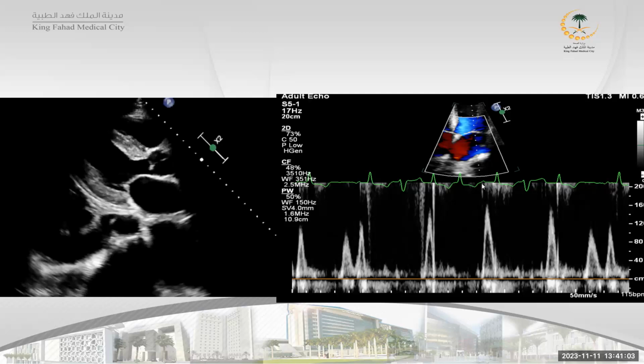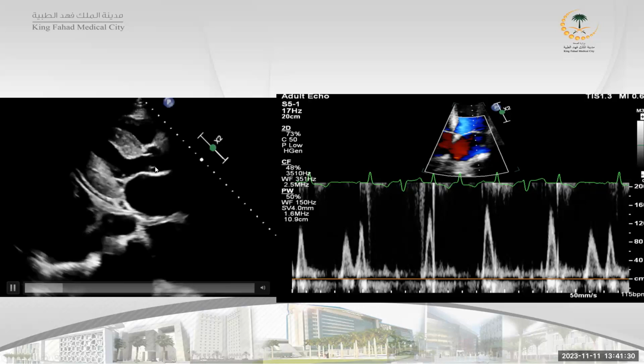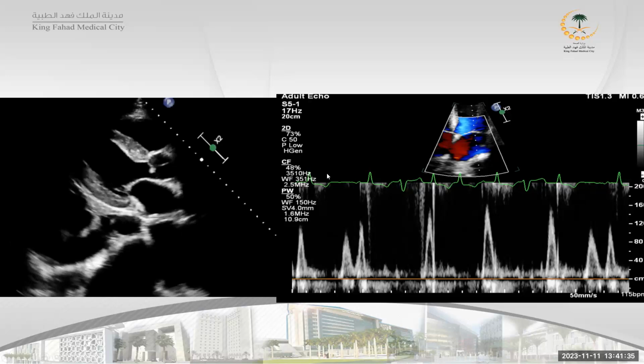So here restrictive cardiomyopathy is very clear. Of course, I cannot see the E and A waves clearly because of the multiple atrial extrasystoles. It is sinusoidal, but this is also an indication that we likely have infiltrative heart disease, with this thickness, pleural and pericardial effusion and left atrium dilatation, and sometimes also thickening of the mitral valve and aortic valve. Likely we are talking about amyloidosis.